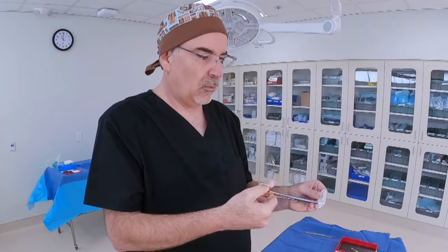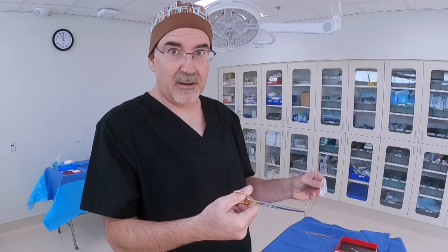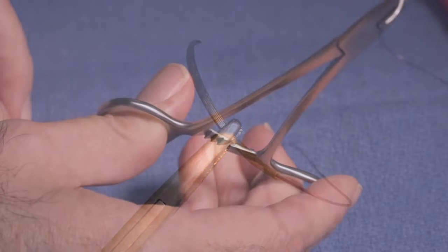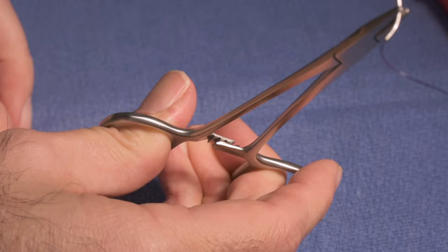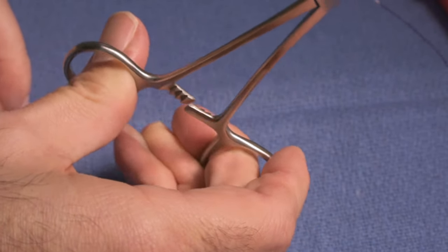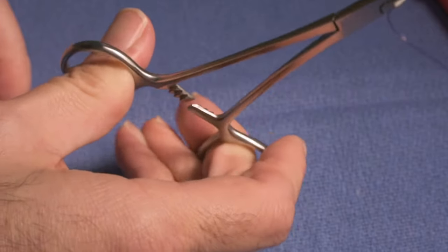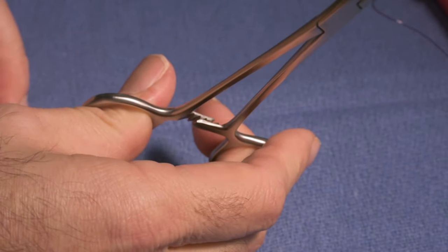A well-loaded needle is not going to be right at the tip of the needle driver — it's actually going to be loaded just about a millimeter or so below the tip, so there will be just about a millimeter of the needle driver sticking up above the needle itself. When you latch it, you're going to latch it to the first ratchet on the needle driver. You're not going to clamp way down because then the surgeon will have trouble getting it off.